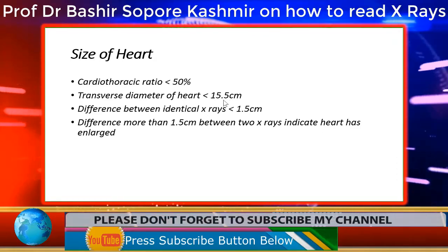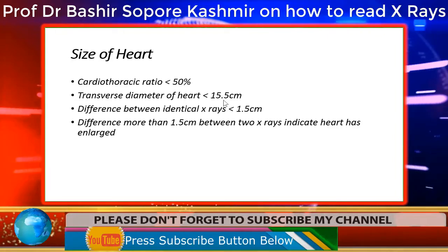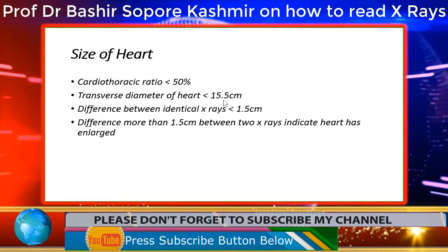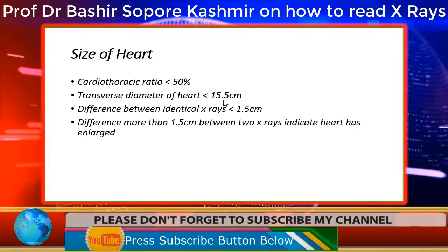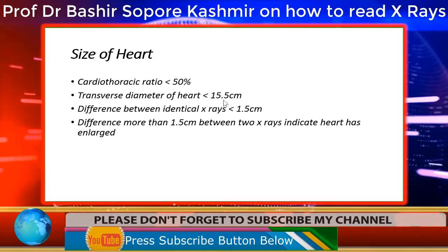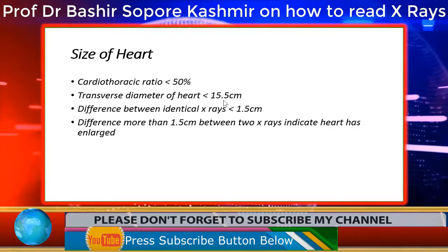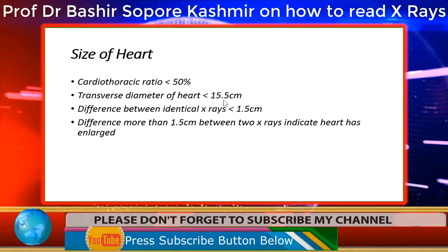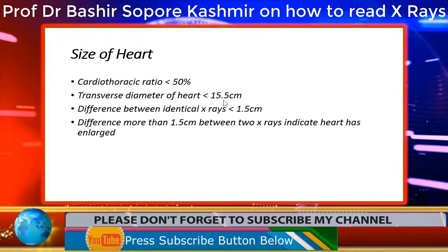Now, I give you here an example. Suppose you take two x-rays. In one x-ray, you find that the cardiothoracic ratio is, for example, 50%. And after 2 or 3 months, you take another x-ray and you find that the cardiothoracic ratio is slightly more. Then will you call it cardiac enlargement or not?